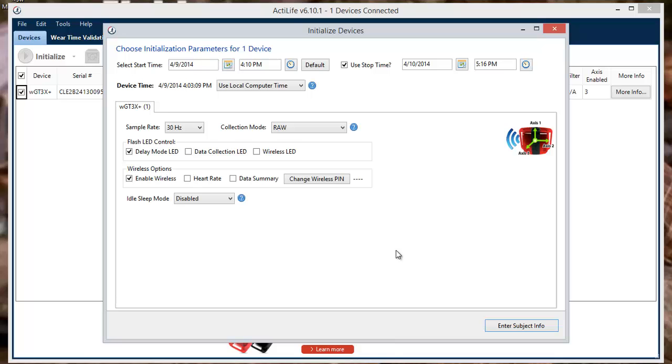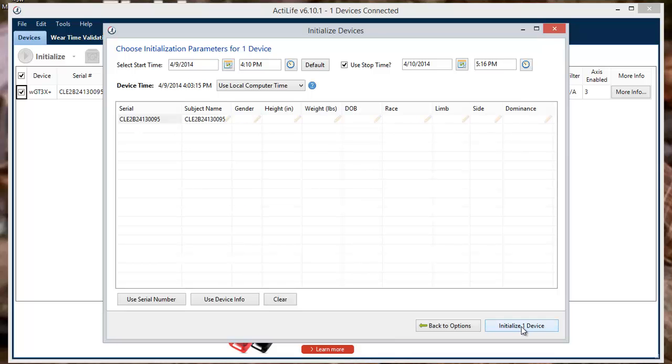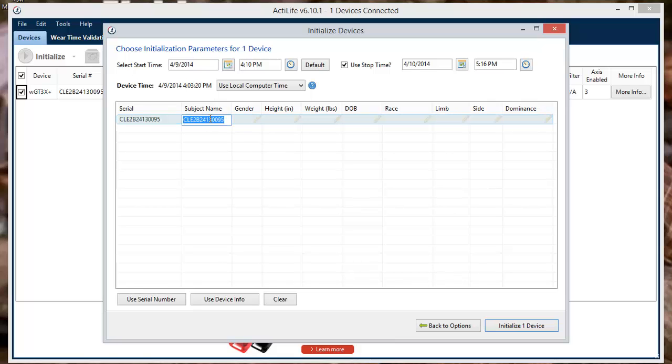Once your device's parameters are set, you can enter or alter the subject's information by clicking the button in the bottom right corner. The subject's information isn't required for initialization but can be entered to better manage your devices.